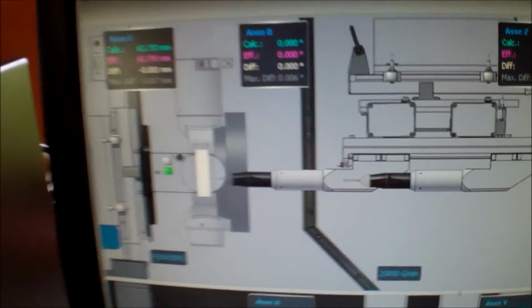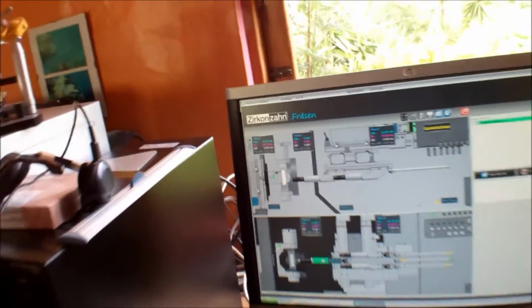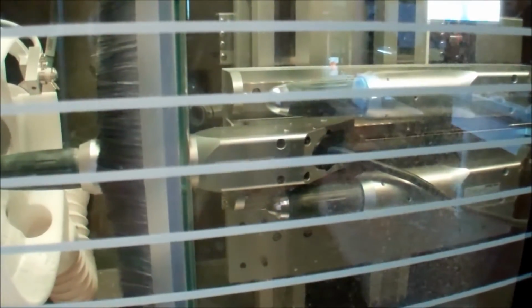While Mr. Favini's on the phone, this is displaying exactly what's happening in the Zirkonzahn CAD-CAM M5 machine. And that disc in there, I believe, from some research I've been doing, is a blank. It's maybe an inch and a quarter thick, round disc of zirconia. Then the model of the teeth is loaded into the computer system, and the robotic arm just starts drilling away to make an exact copy of the model that was loaded in there. It's very fascinating stuff. Looks like 3 different drill bits. I'm sure each one has a different drill bit in it.